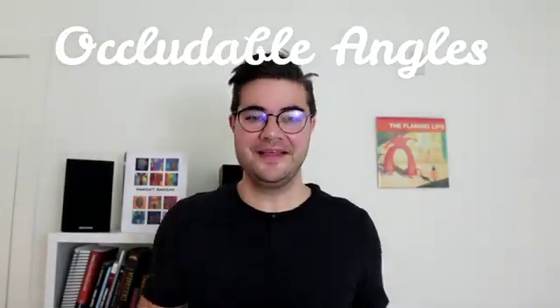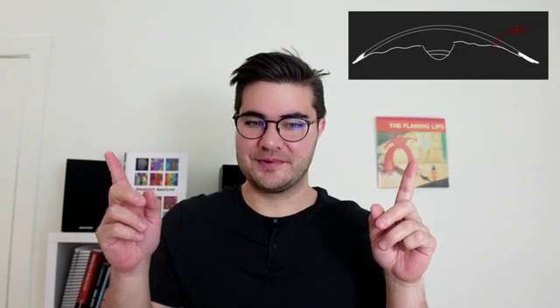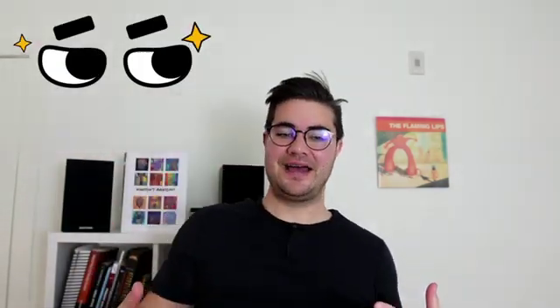Number 2. Occludable angles. Story time. On one occasion, as a student, I had a patient with around a 1/3 to a 1/4 angles, nasal and temporal, in both eyes, and it was a pretty busy day. This patient had a bit of trouble doing tono on. They had really tight eyelids and were not liking things coming close to their eyes.